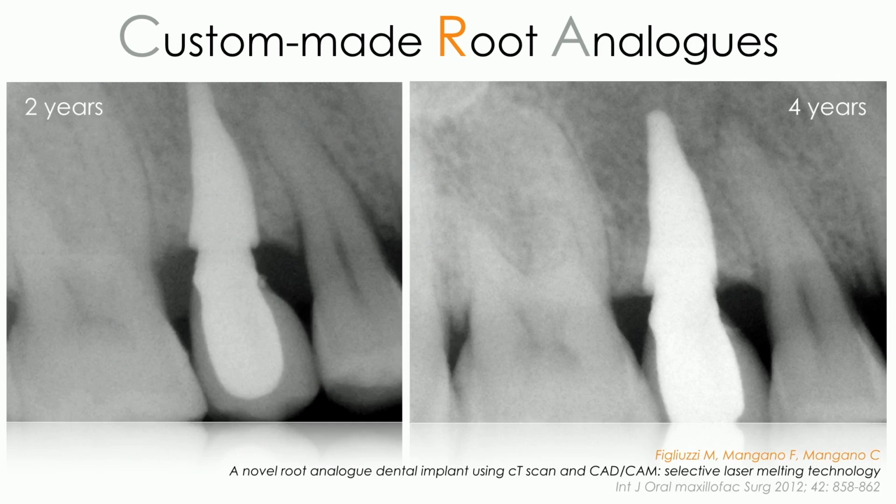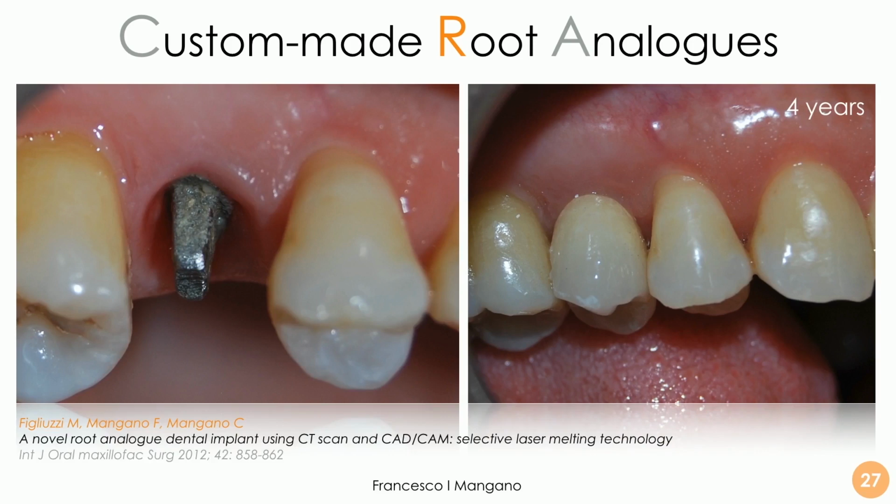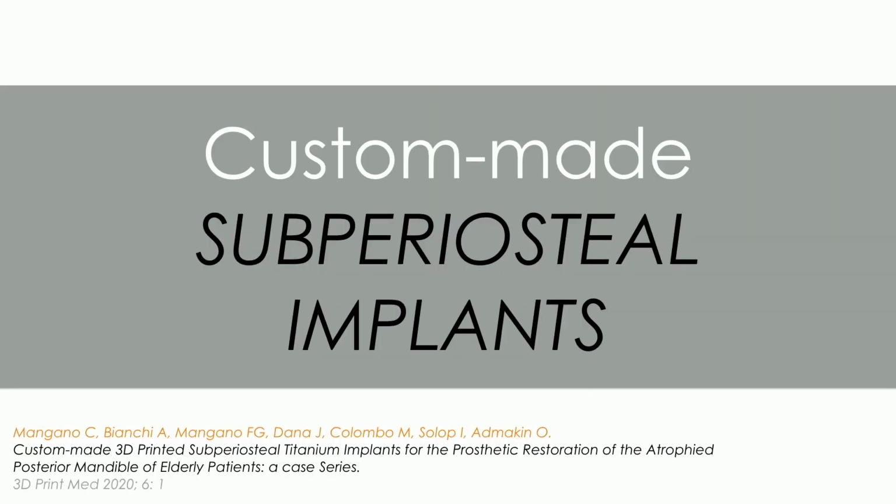And here the follow-up, as we can see, very stable bone level, no issues at all clinically after a long time, and very good integration from the clinical perspective. So it's an option, it's possible through segmentation, to use DICOM from cone beam computed tomography, but it's not all. We can also design our subperiosteal implants.